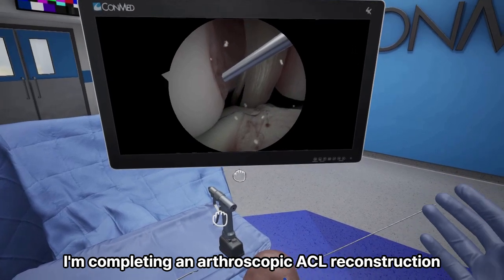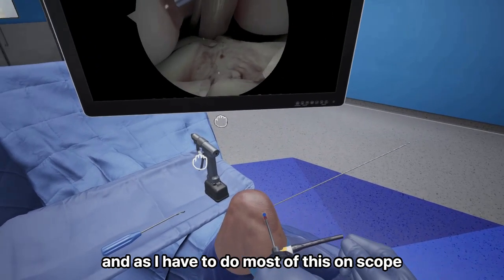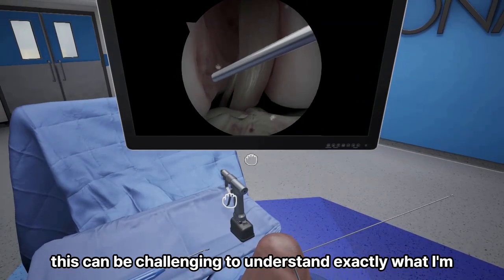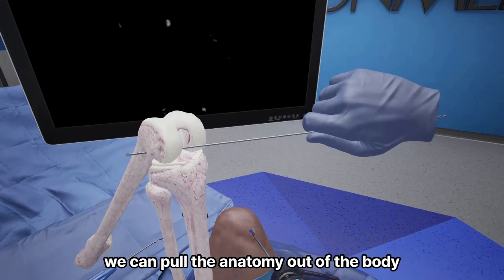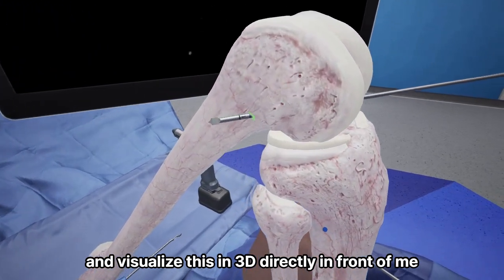I'm completing an arthroscopic ACL reconstruction, and as I have to do most of this on scope, sometimes, if I'm a novice learner, it's going to be challenging to understand exactly what I'm after. However, we've developed the ability to do this in sawbones mode. We can pull the anatomy out of the body and visualize this in 3D directly in front of me.